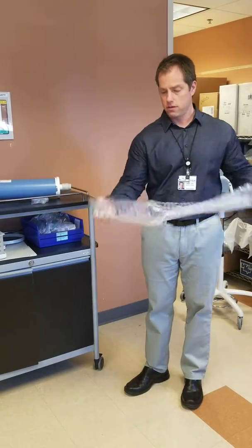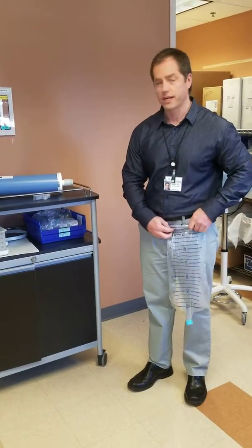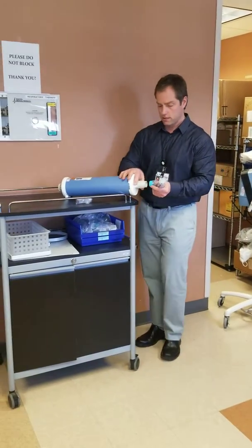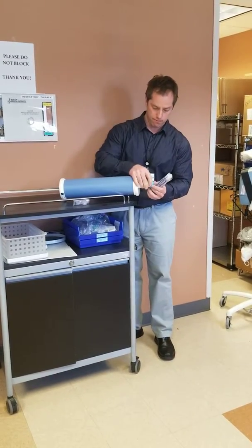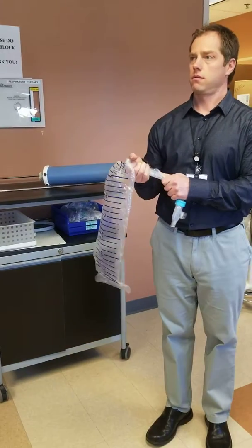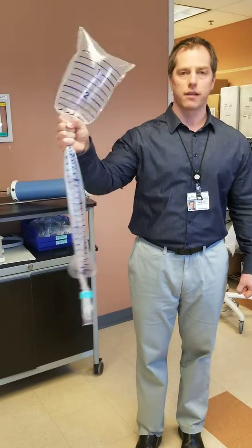To give an idea of accuracy, we'll put this on the spirometer calibration syringe and see what 3 liters looks like, because we're pretty confident we can get 3 liters out of that. Just let it collapse down — and that's what 3 liters looks like when blown out of the calibration syringe.